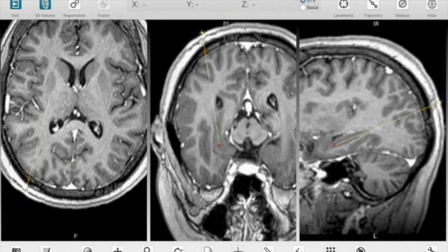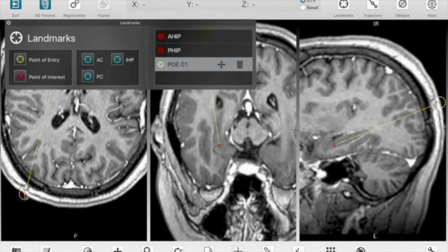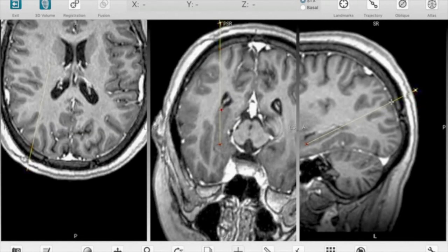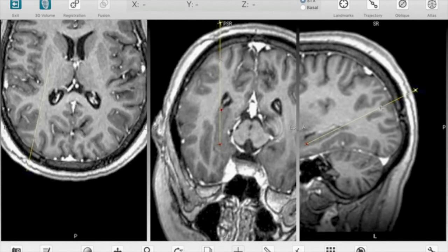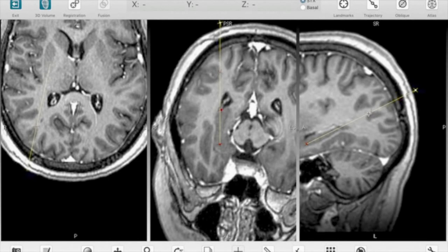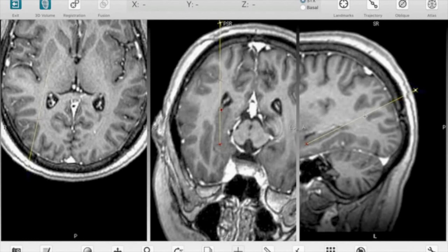A hard cannula, as the one used for the anterior nucleus of the thalamus and the centromedian nucleus, ensures not only an adequate electrode route, but also penetration within hardened structures such as the sclerotic hippocampus. After defining the entry point, it is necessary to ensure no major vascular structure or superficial or deep sulci are crossed along the trajectory.